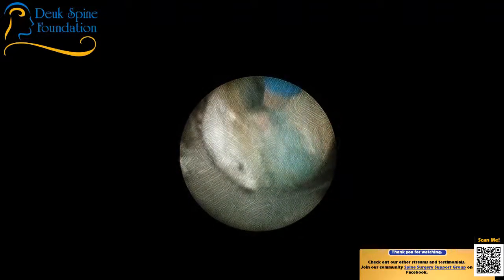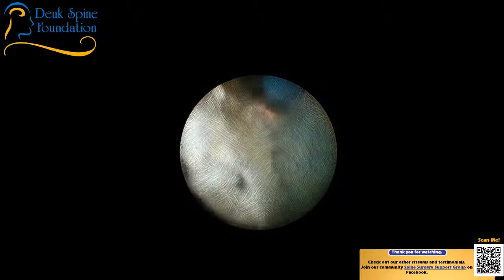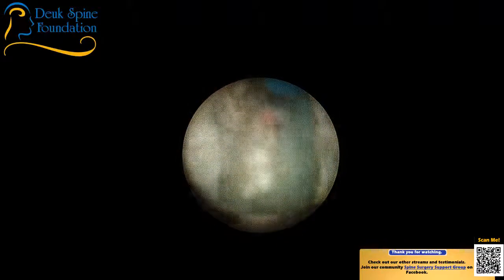All right, that's the foramen, by the way, and things are looking good. I've gotten all the herniation out. The nerve root's just up there. I don't see anything else.